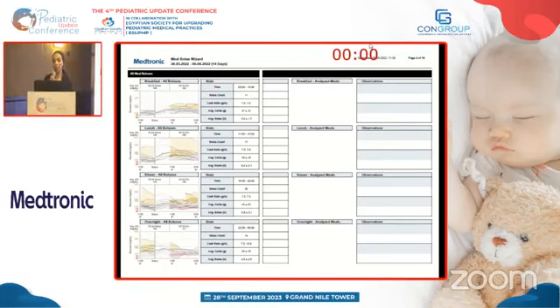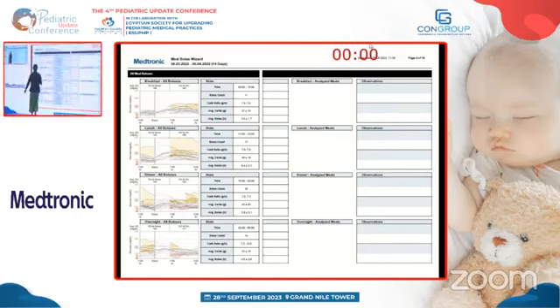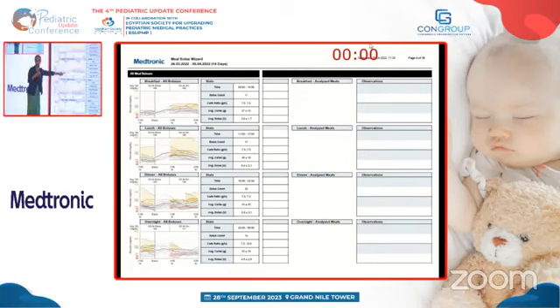نفس الكلام بيحصل في اللانش برضو، هو قبل الدوز. يعني هتلاقوا فيه كده خط فاصل هنا. بص هتلاقوا هنا خط فاصل، الريدنج بتاعتي، الدوتد لاين، البلاك سوليد ده بيقول لي الأفريج بتاعت القرايات كلها ديورنج التو ويكس كلها عاملة إزاي.